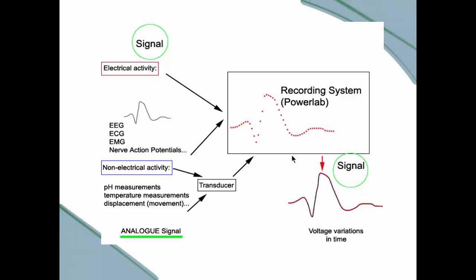And so as you can see here, this analog signal is coming in. Now, how do we change that analog signal into a digital signal? This is another important area that we've now gotten into in technology. We can take analog signals, convert those to digital signals, and therefore create a digital substrate that we can analyze.